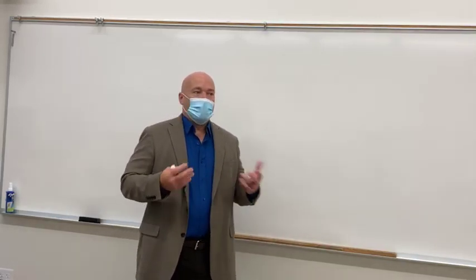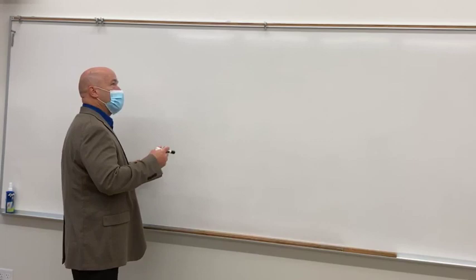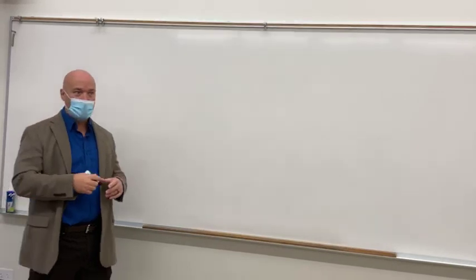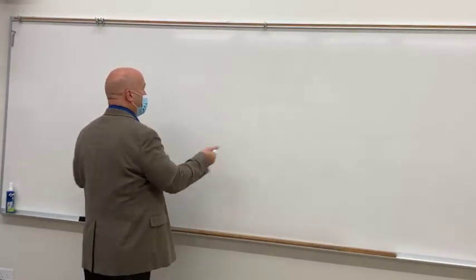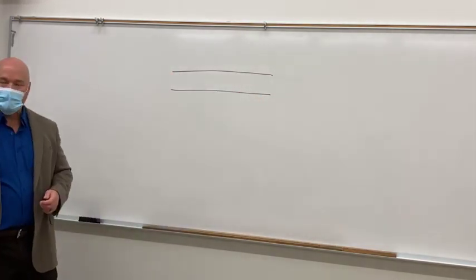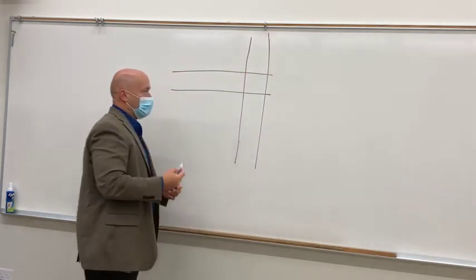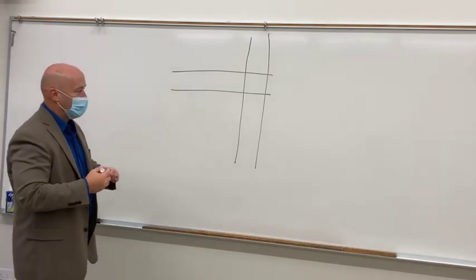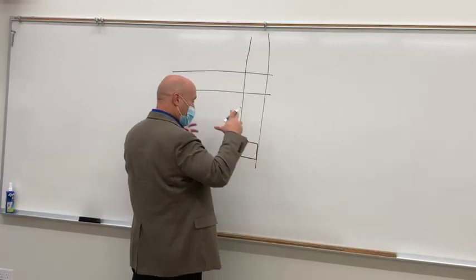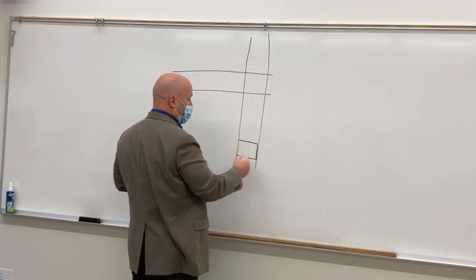With a radiography room, you go into clinicals tomorrow, and what you should see if you look up at the ceiling is rails. Or you go into the lab today, you'll see them. Some will be embedded into the ceiling, and they'll go the length of the room in one direction. They're not very far apart, but that's one set of rails. And then there's another set of rails that goes perpendicular to that. So there's two sets of rails mounted perpendicular to each other, and then you've got the tower with the x-ray tube. You're looking down from the ceiling. The x-ray tube will be underneath all this, and it rides on the second set of rails.